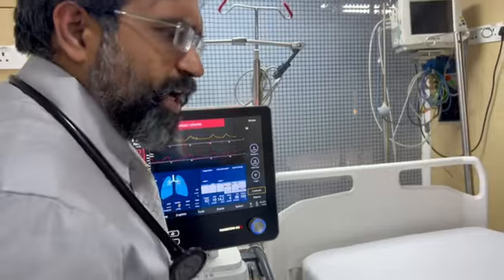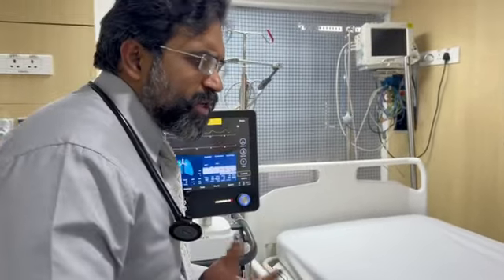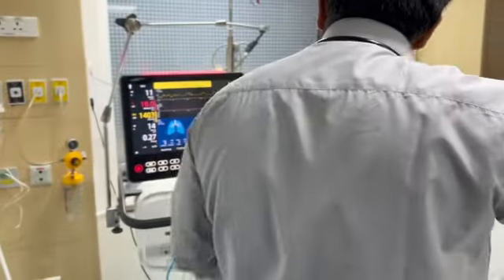Now what I'm going to do is try to use this with the high flow nasal cannula, the humidified circuit. So let me first switch this off. Let's switch this off first. I'll hold this for you. Switch it off.